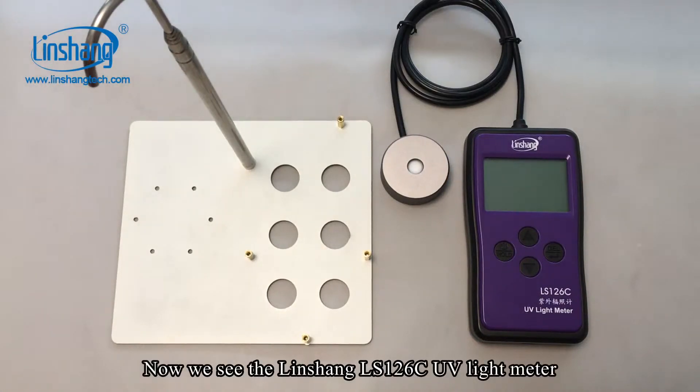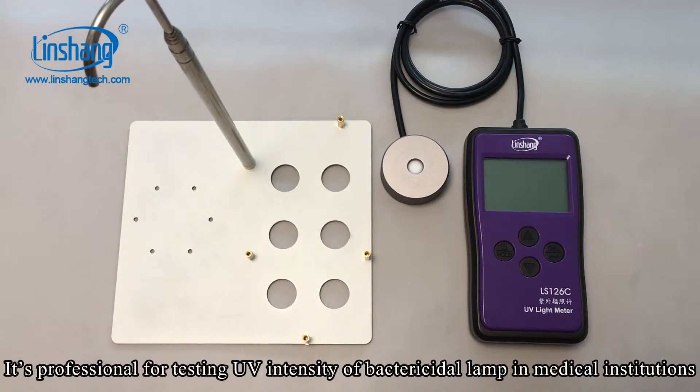Now we see the Linshan LS126C UV light meter. It is professional for testing UV intensity of bactericidal lamps in medical institutions.